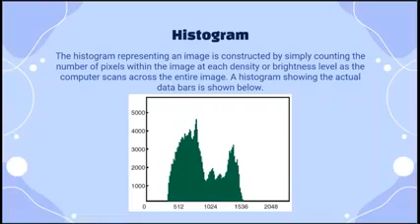Okay, thus metallic objects or contrast agents would be represented on the far left of the graph. They are on the far left because your contrast agents and metallic objects appear white on the radiograph, followed by the bone, then soft tissues, near the center, fat, and finally gaseous or air densities to the far right. Okay, so this area here, the anatomy you see here is those that contain air, such as the lungs. Okay, so the color of air in the radiograph is black.